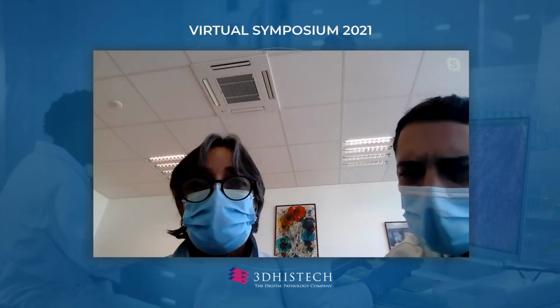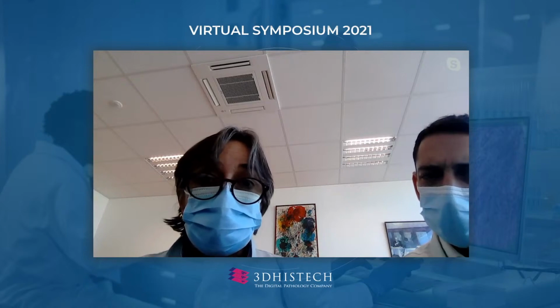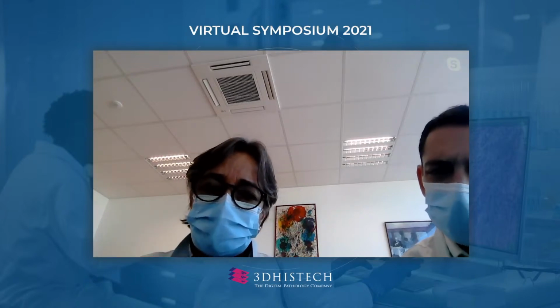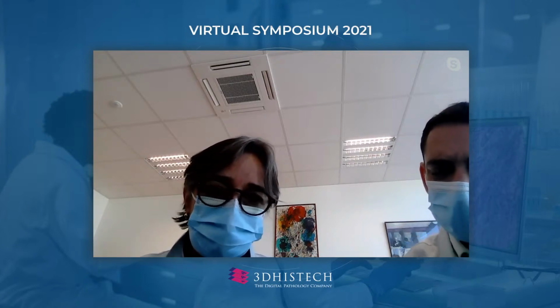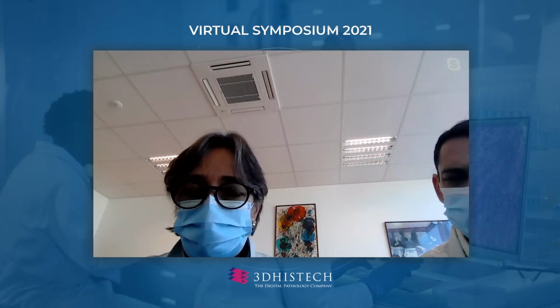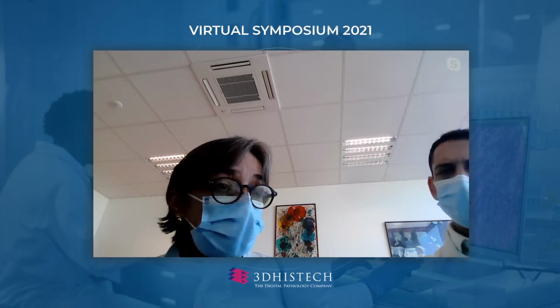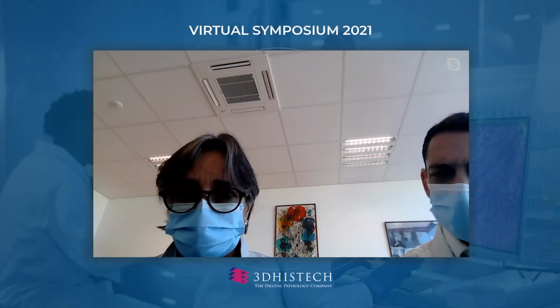One more. Yes, we use digital pathology routinely for frozen sections coming from the two other hospitals, Paul Brousse and Béclère. But in the main site, we perform, I would say, conventional frozen sections with glass slides. But it is really easy to read digital frozen sections, and our results show there is the same diagnostic accuracy on digital frozen sections compared to conventional frozen sections.